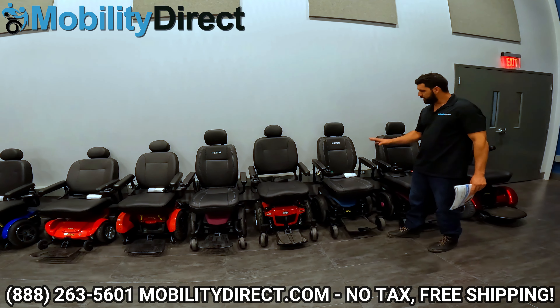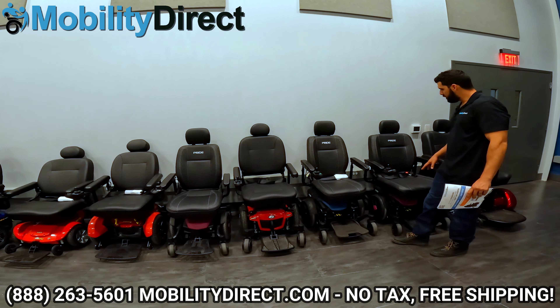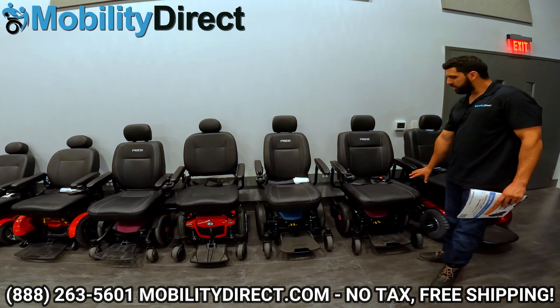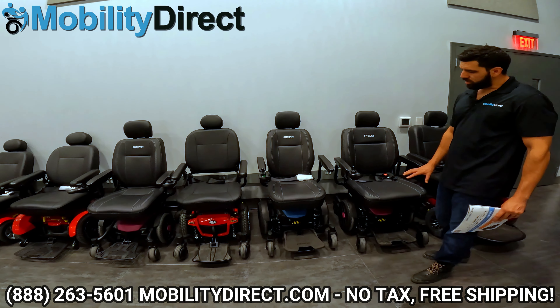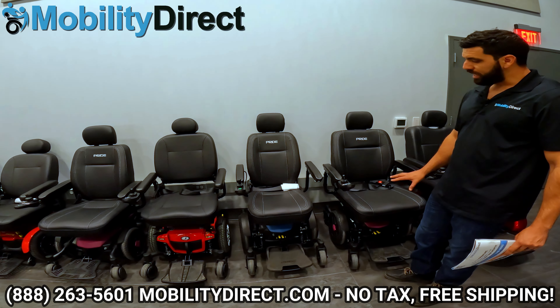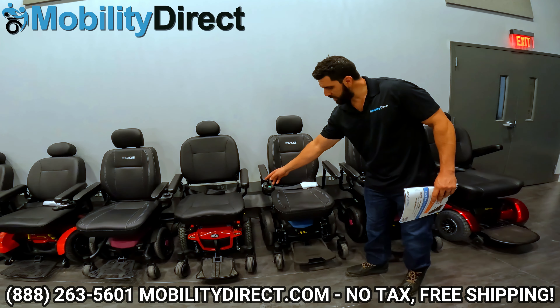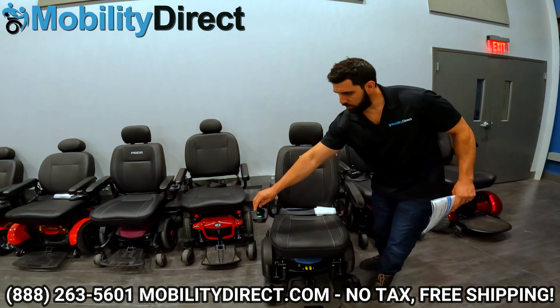The 614 does come in a 614 HD version which has a better weight capacity rating, wider seat options, and an adjustable suspension, but aside from that they're both pretty much the same. So I'm going to bring out the 614 standard and we'll start reviewing it.